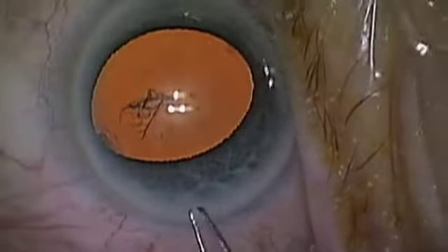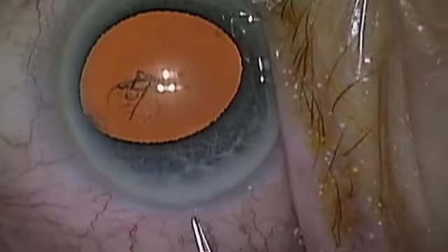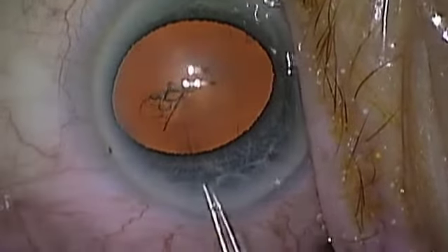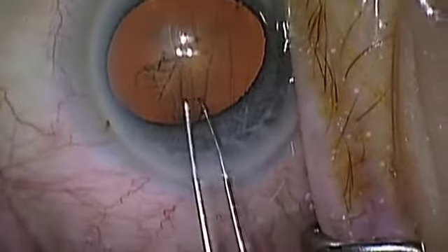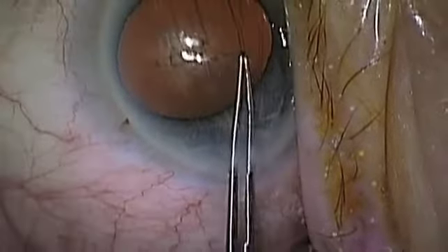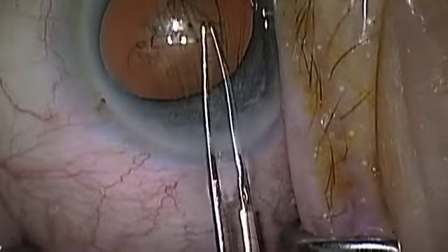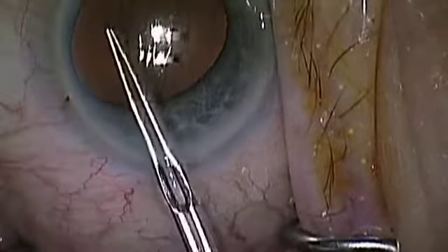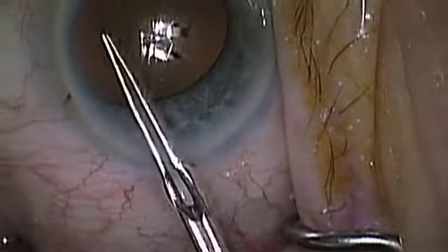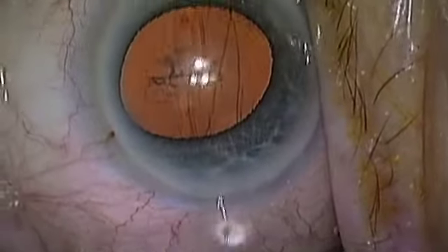Irrigation to improve the view is then performed, and using this special forceps introduced through the incision, the capsular flap will be grasped and a circular capsulotomy will be completed. At the end, you will see there is a relatively perfect circle torn in the anterior capsule.